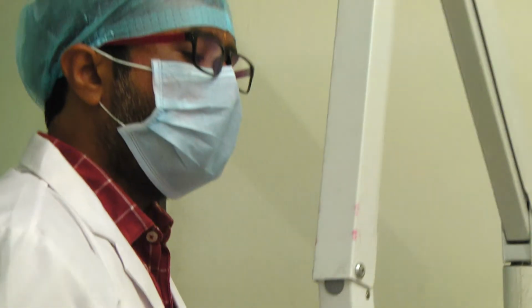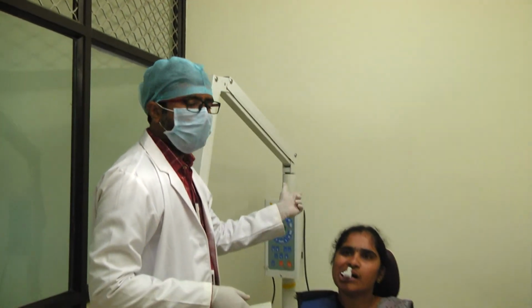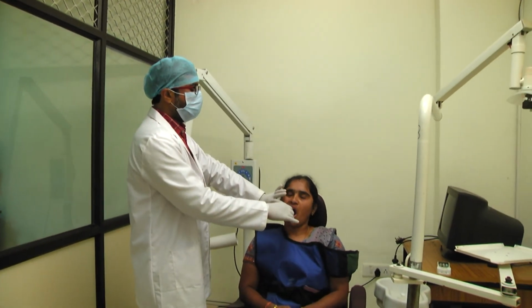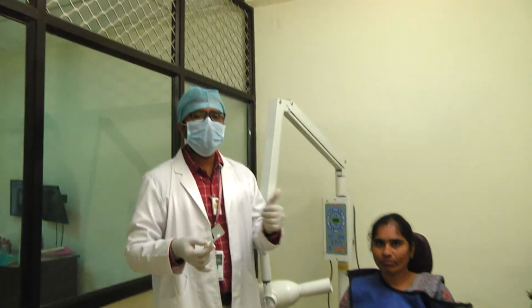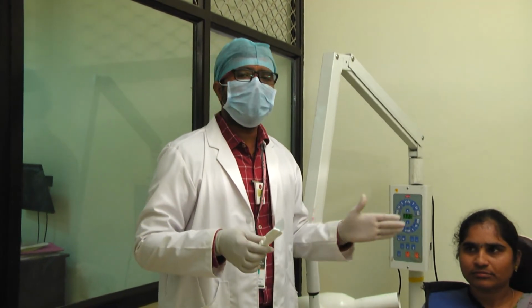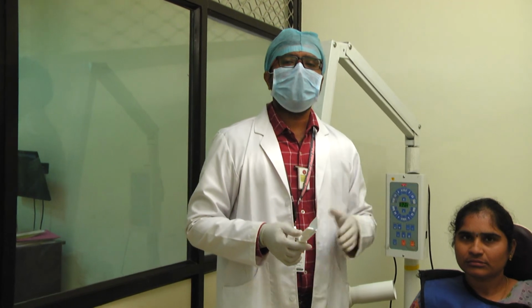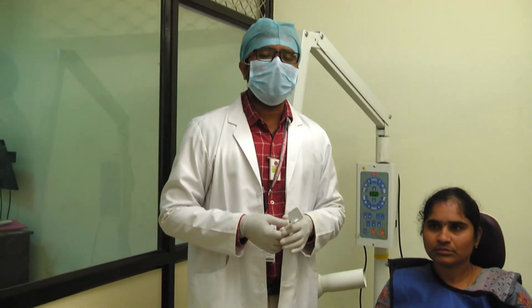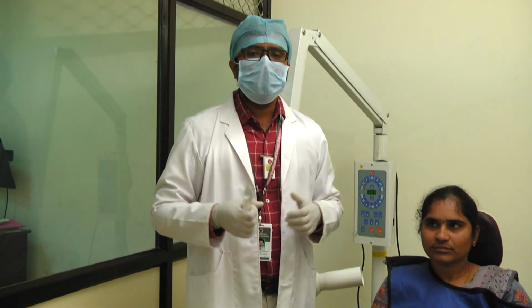So this is how you should follow the projection for all the teeth. Once it is properly positioned, the radiograph should be taken, and this radiograph should be properly washed and dried to ensure proper film processing. If you follow all these fundamentals, rules and positions for taking maxillary and mandibular radiographs with the bisecting angle technique, you will get an ideal radiograph, which is a diagnostic image. Thank you all.